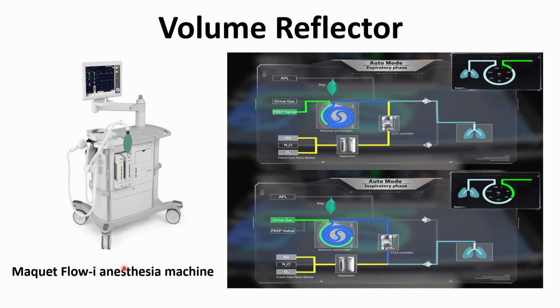Have you used the Maquet Flow-i anesthesia before? Yes. Do you know how it works? It works by a volume reflector, and you should know this. He will not go into deep details for this mechanism.